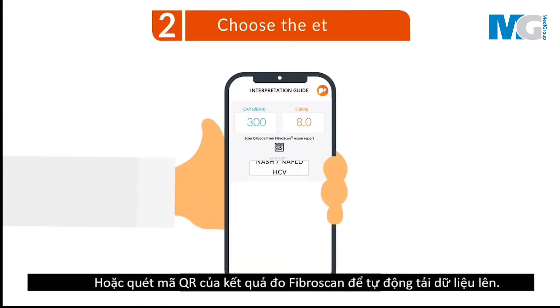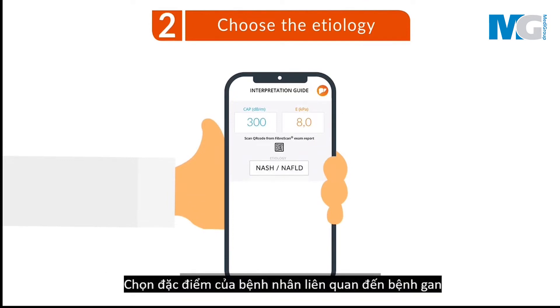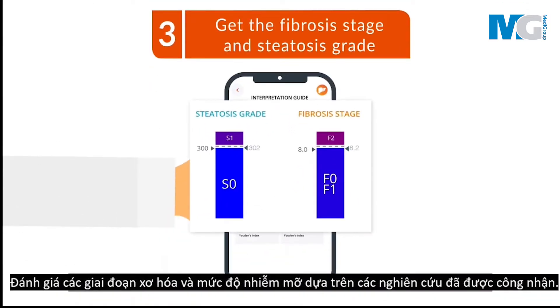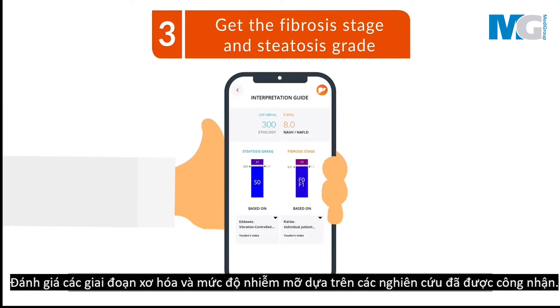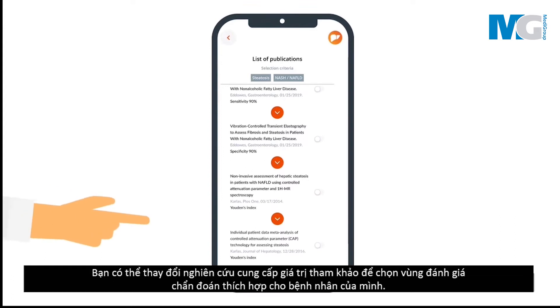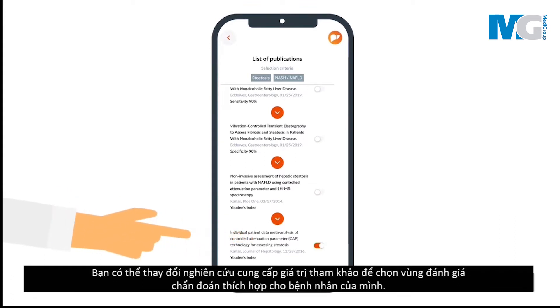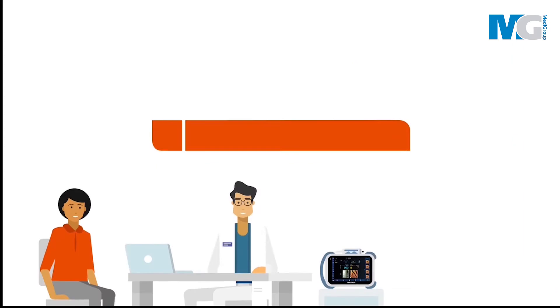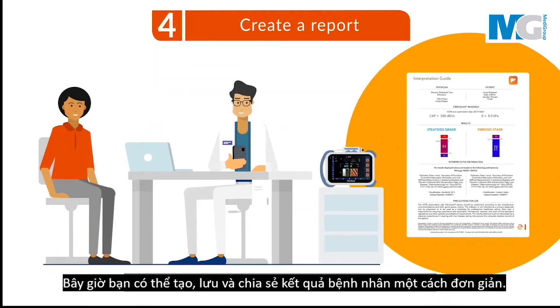Choose the etiology of liver disease. Get the fibrosis stage and steatosis grade based on peer-reviewed publications. You can change the reference publication to select the appropriate diagnostic cutoff for your patient. You can now create, save, and share your patient report.